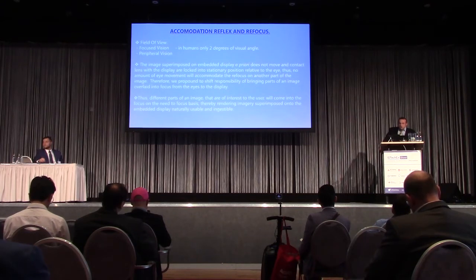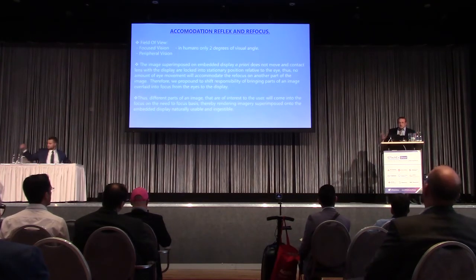What we need to do is detect the change of focus of the eye from the external plane. If we are talking about just an AR, augmented reality application, that means we are going to be dealing with a semi-transparent display of some kind, built into the contact lens.